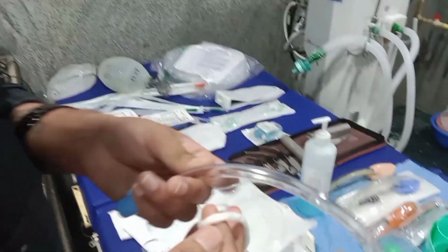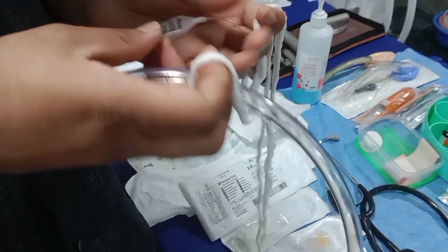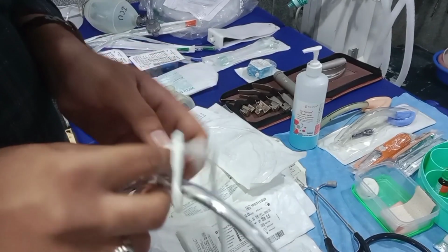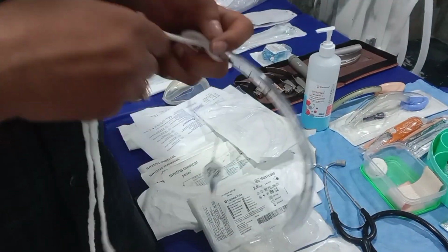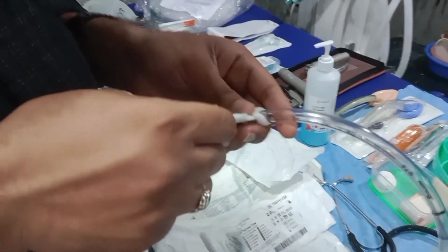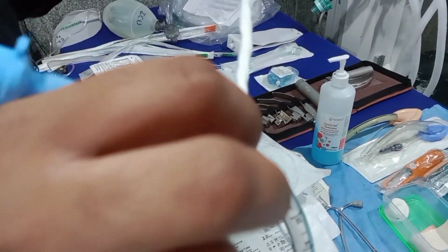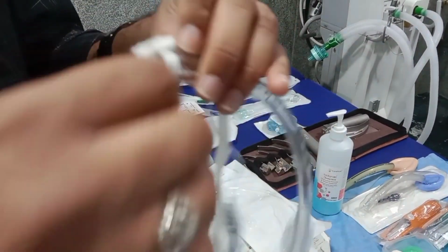We tie it like this, and we should make sure that this is visible and it is along with the tube. So the first knot we put like this. There are two ends. One end you take to one side of the patient's mouth, and the other end you take laterally.